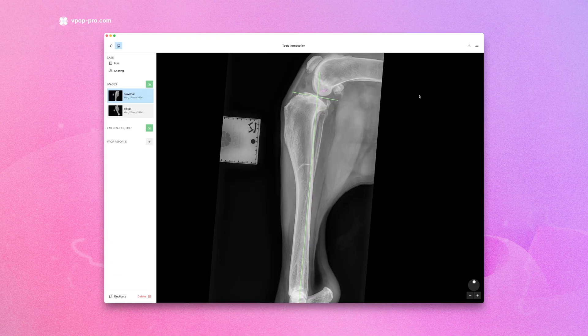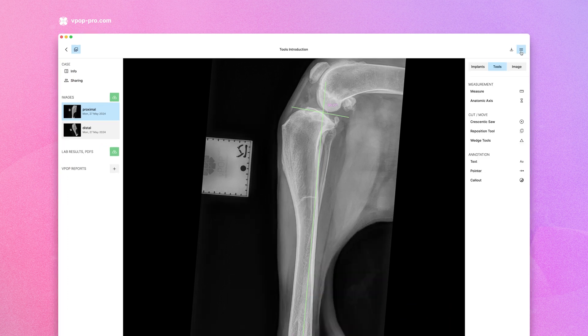To find the Crescentex Saw tool, open the menu in the top right corner. Choose Tools and select Crescentex Saw.